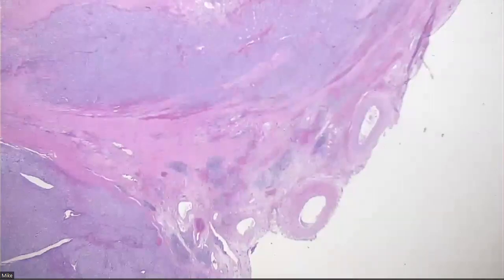Because of this difference, most of the things that were called poorly diff in the past tended to arise from follicular carcinomas. And now high grade diff tends to be papillary.